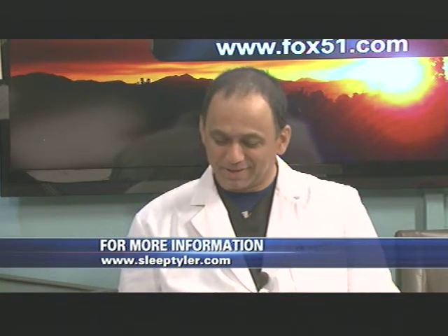Well, now, what are the big differences between the CPAP and the mandibular device? Could you explain that to us? Surely. A CPAP is a machine that requires electrical power. It has a hose and a mask that goes with it. You have to carry all that with you. The oral appliance is something like this. Oh, wow. So it can fit in your purse. It can fit in your handbag. It does not need electrical power. It is customized to your teeth. You carry it with you everywhere.